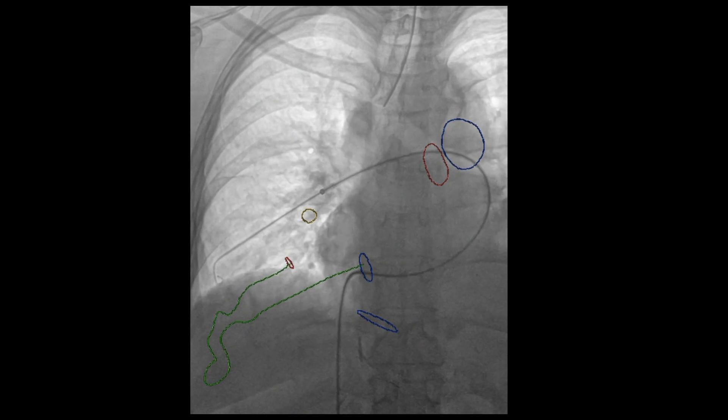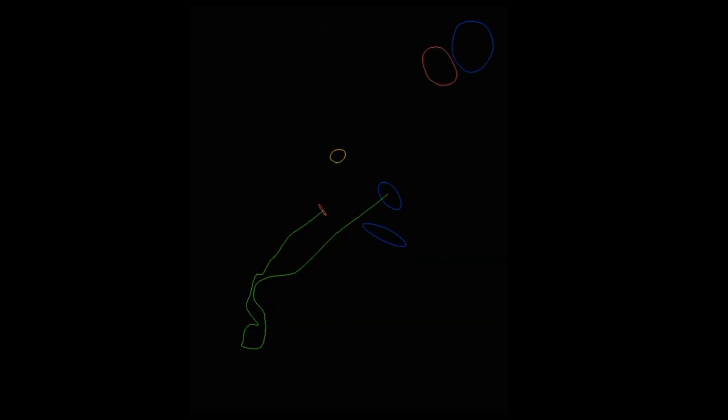The fiducial markers shown on the screen are made possible after fusing the preoperative CTA with bony landmarks on the fluoroscopy. The right big blue circle on top of the screen demonstrates the left main pulmonary artery, and the right circle adjacent to it demonstrates the right pulmonary artery. The smaller red circle towards the left end of the screen demonstrates the feeding pulmonary artery into the AVM. The green line indicates the course of arterial inflow into the pulmonary AVM and the venous outflow, and the blue mark at the end of the green line is the inferior pulmonary vein. The blue circle just inferior to this is the inferior vena cava.